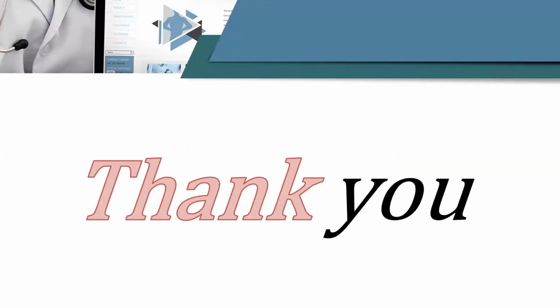Thank you, Dr. Pankaj. We do have a couple of questions, and it looks like you answered one. The first one was, can we use film when using CR or DR? I saw that in your video. If you'd like to expand on that, please. Yes, actually, we can use the film after erasing the previous X-ray which was taken. We can use that film again.